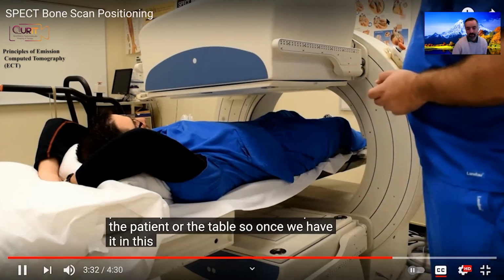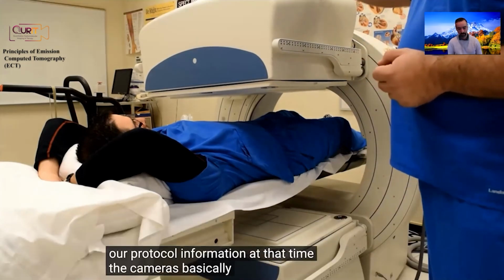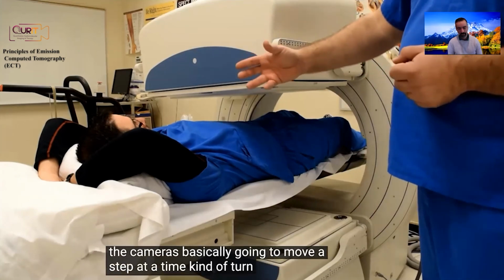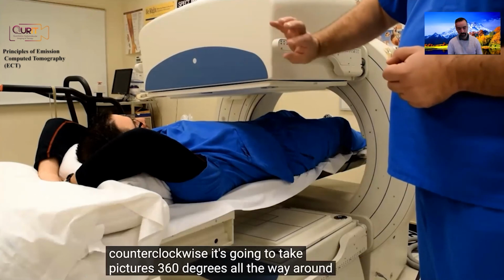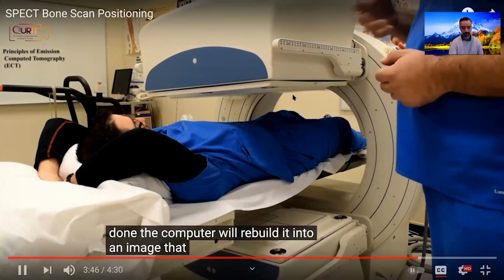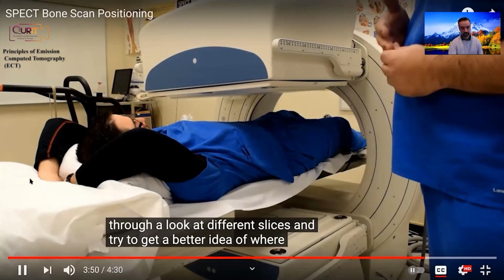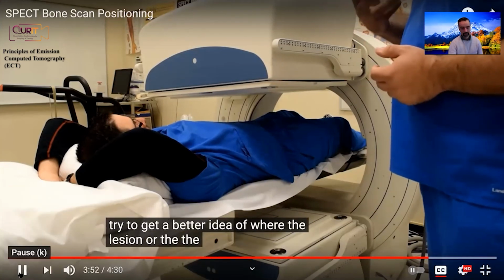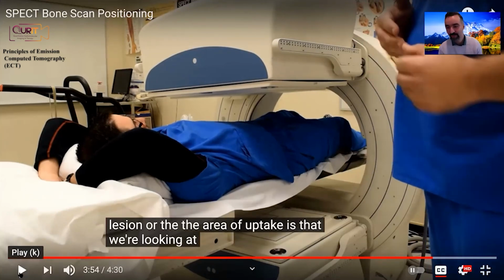So once we have it in this position, we'll go ahead and enter our protocol information. At that time, the camera's basically going to move a step at a time, kind of turn counterclockwise, and it's going to take pictures 360 degrees all the way around. At that point, once you're done, the computer will rebuild it into an image that the physician can go through and look at different slices and try to get a better idea of where the lesion or the area of uptake is that we're looking at. And the rebuild he mentions, of course, the technical term for that is image reconstruction, which we will talk about more.